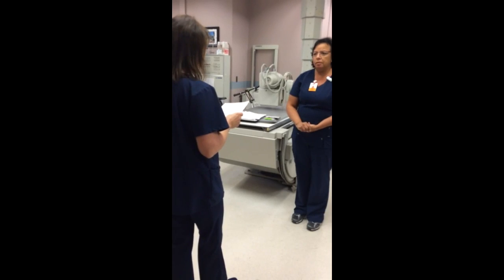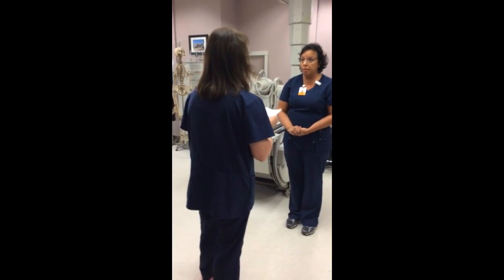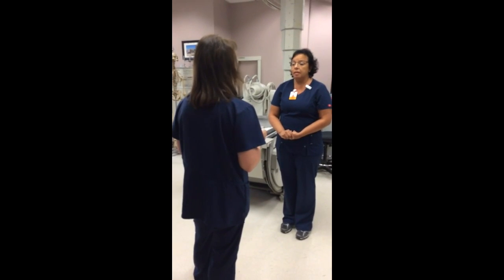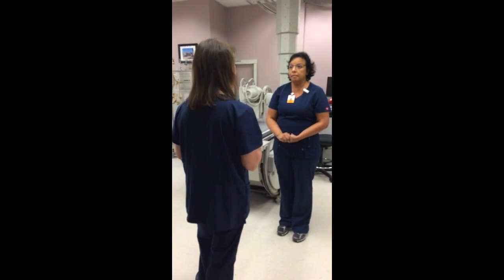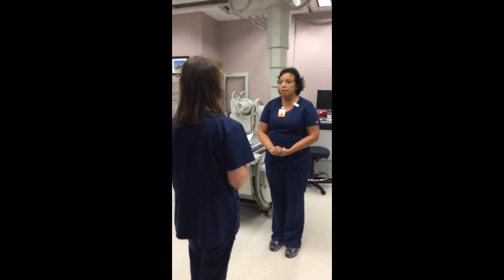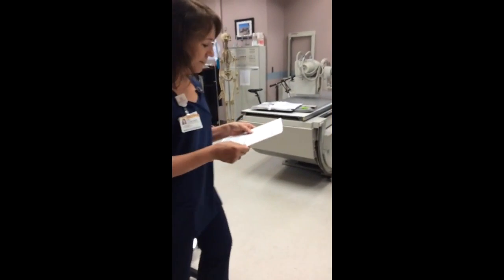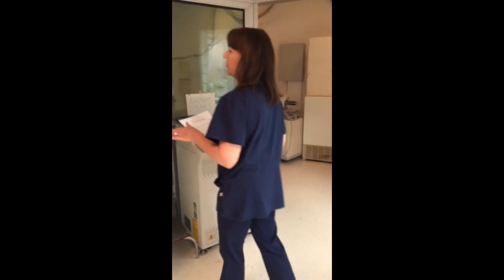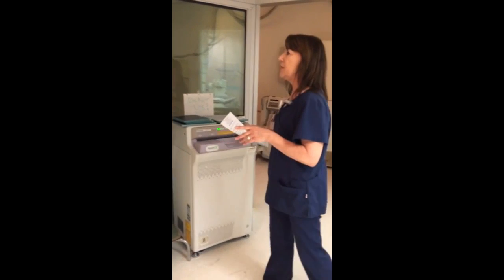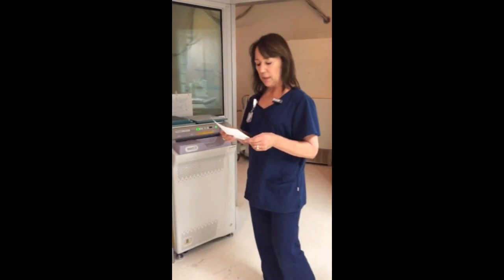No. Okay. All right. Well, the first thing I need you to do is take this gown and go ahead and put it on, and put the opening to the back. Take everything from the waist down off, and then meet me back here, and we will proceed. Okay. Okay, sure. So as my patient's getting ready, I want to recheck my console to make sure that my kV is at 70 and my mAs is at 5.